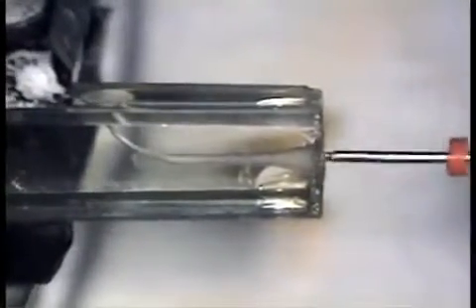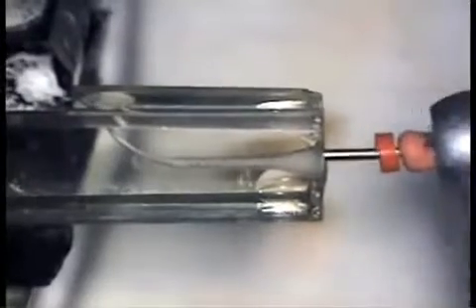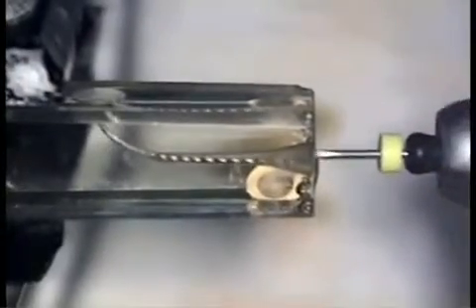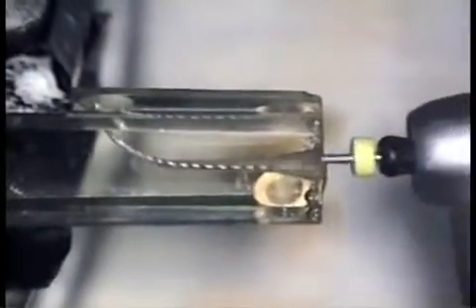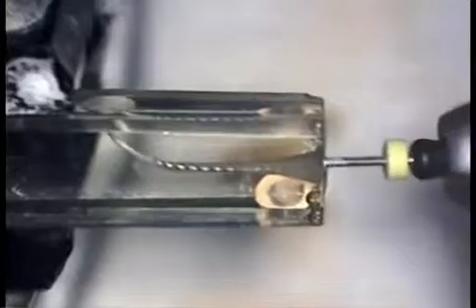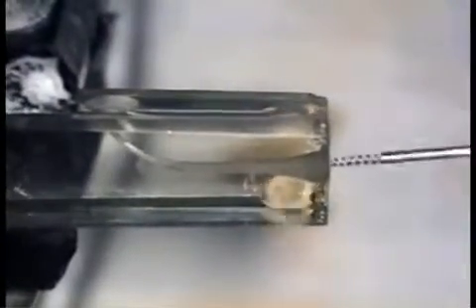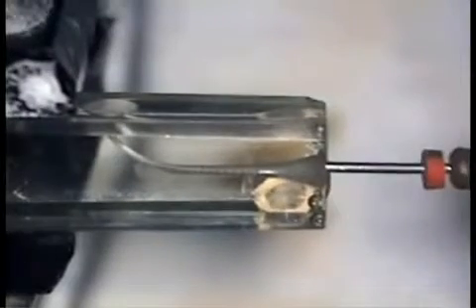In this video, I skipped the 40 1 millimeter short of measurement and went straight to the 25 .06 relieved reamer used in the reciprocating handpiece. I noticed a small amount of bottling between the apical and middle thirds and decided to blend the shapes together by using the 40 and 25 .08 subsequently.